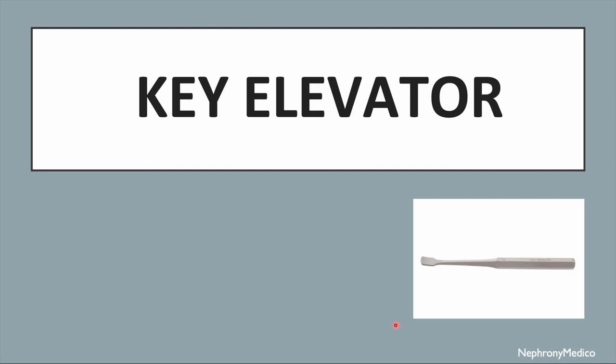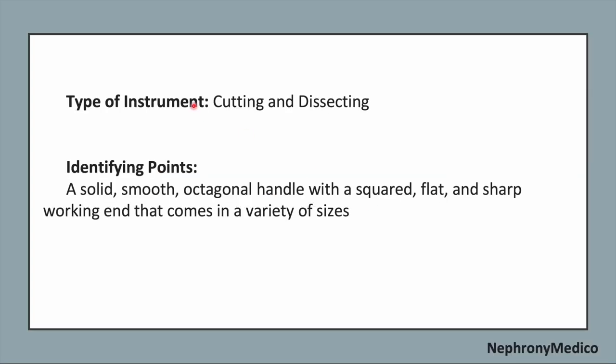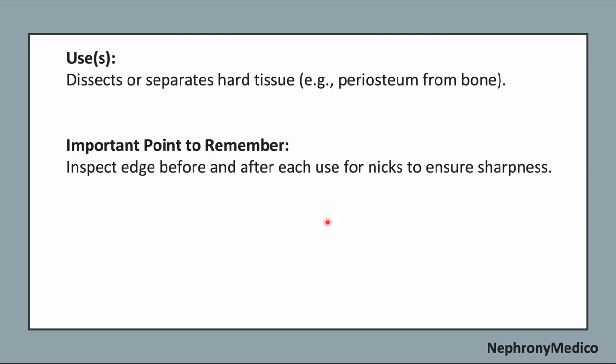Let's talk about key elevator. This is a picture showing key elevator. Now, it is a cutting and dissecting type of instrument. Now, identifying points. A solid, smooth, octagonal handle with a square, flat and sharp working end that comes in a variety of sizes. Use. It dissects or separates hard tissue like periosteum from the bone. Now, important point to remember. Inspect edge before and after each use for nicks to ensure sharpness.